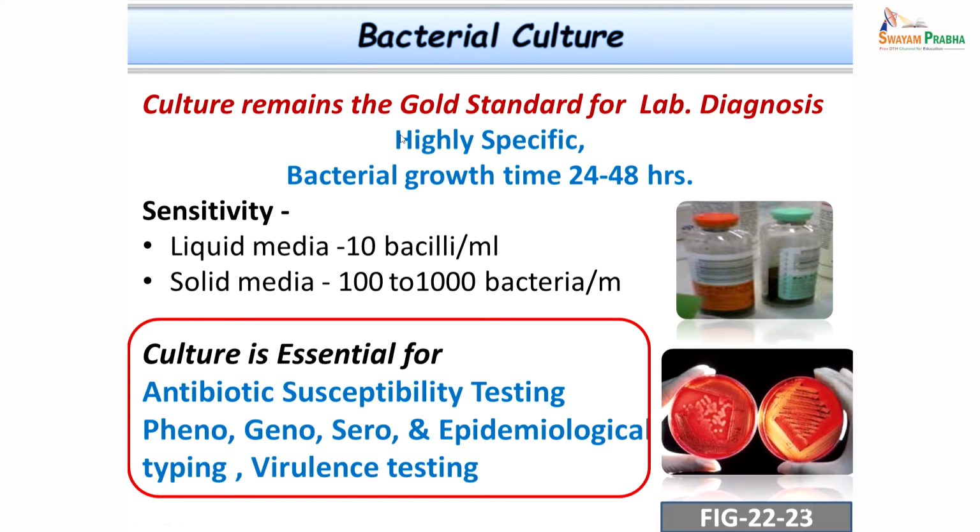Culture remains the gold standard for diagnosis. It is less sensitive, but it is highly specific. The growth time for most of the common bacteria is within 24 to 48 hours. This is good news for anybody attempting bacterial cultures. The sensitivity of solid media is quite less compared to liquid media.